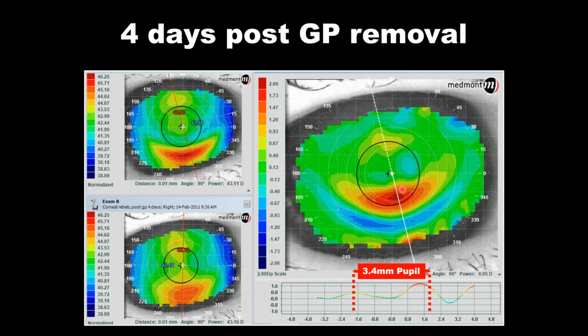And when we go to the subtraction, you see how much action has happened in corneal change within that 4 days. Where we see this hotspot, that's where the eye is steepening up, where it's taking back its normal shape. We see this flattening here, where the contact lens was obviously creating steepening when it was on eye and molding that contact lens, molding the cornea. So there's a lot of things that are returning back to equilibrium or back to normal shape. And this subtractive map is incredibly valuable.